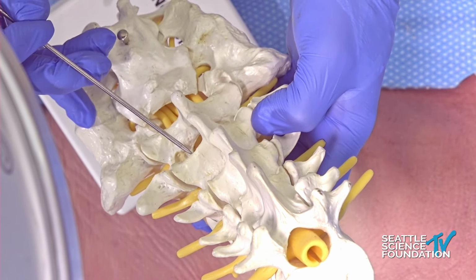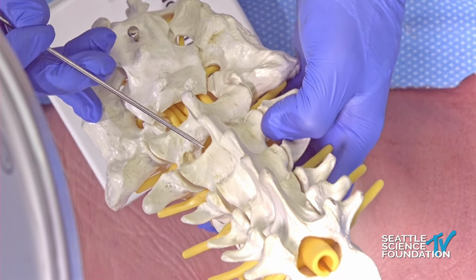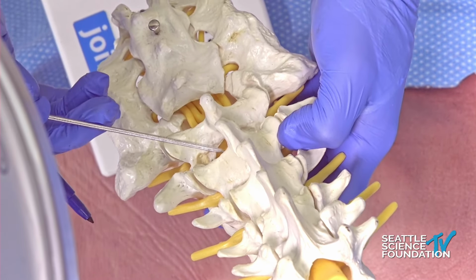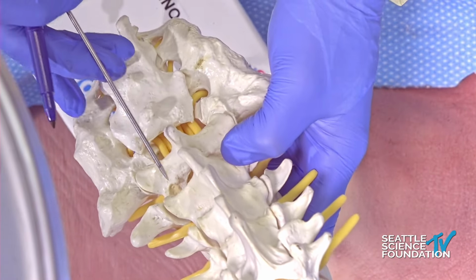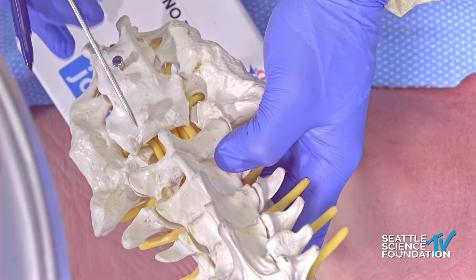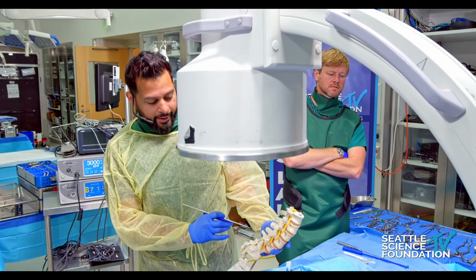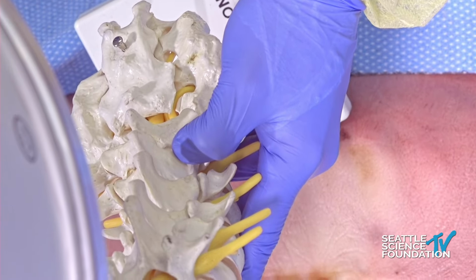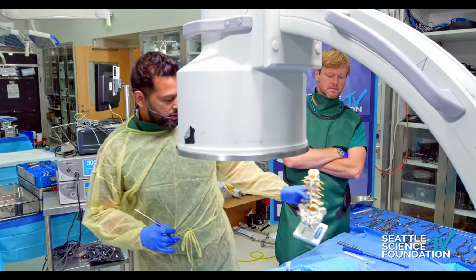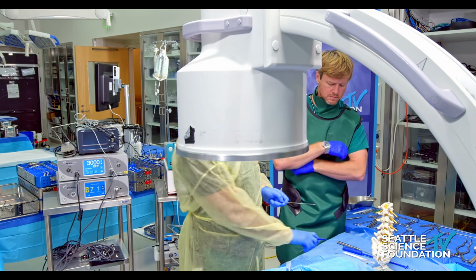And if you're going to be going for a ULBD or over-the-top decompression, it's better to be up here, because you want to undercut the spinous process and go around like that. So what I'm going to do today is very quick. We're just going to show you how to target down there. The key features, which John probably pointed out, are imaging, palpation, and visualization, which is what we're going to show. And I think the other guys are going to show the visualization part.